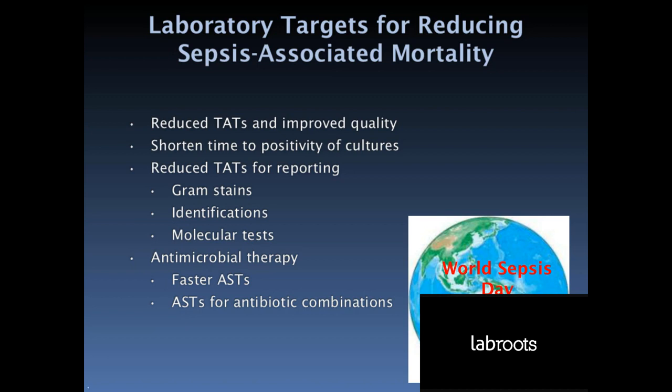To me, the short incubation time for the EUCAST test versus the much longer incubation for the CLSI test indicates very different mindsets, with the EUCAST priority being clinical relevance and the CLSI priority being reproducibility. It seems crystal clear to me which is the better test in the light of risk of mortality in sepsis increasing every 1 hour of delay.